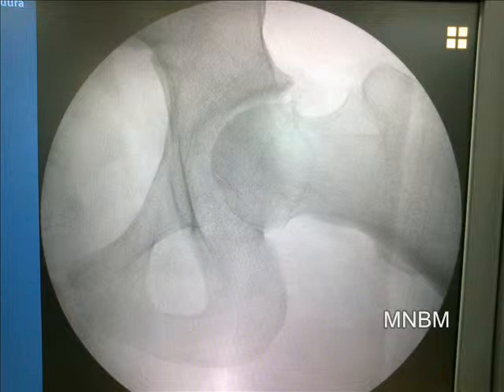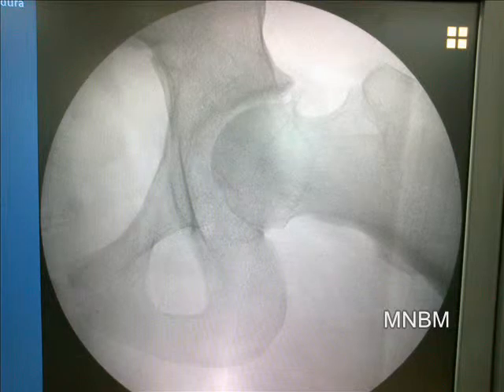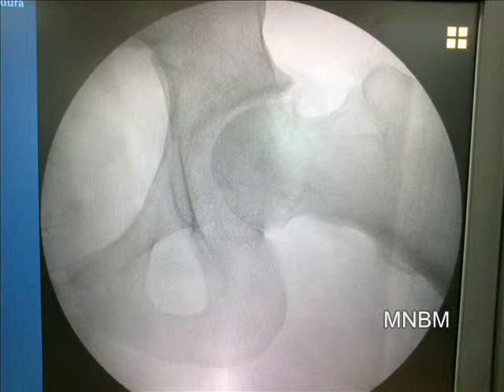He was diagnosed to have a femoroacetabular impingement from osteophyte formation due to capsular sprain. Arthroscopy was performed in a supine position on a fracture table with the hip distracted and flexed to 15 degrees.